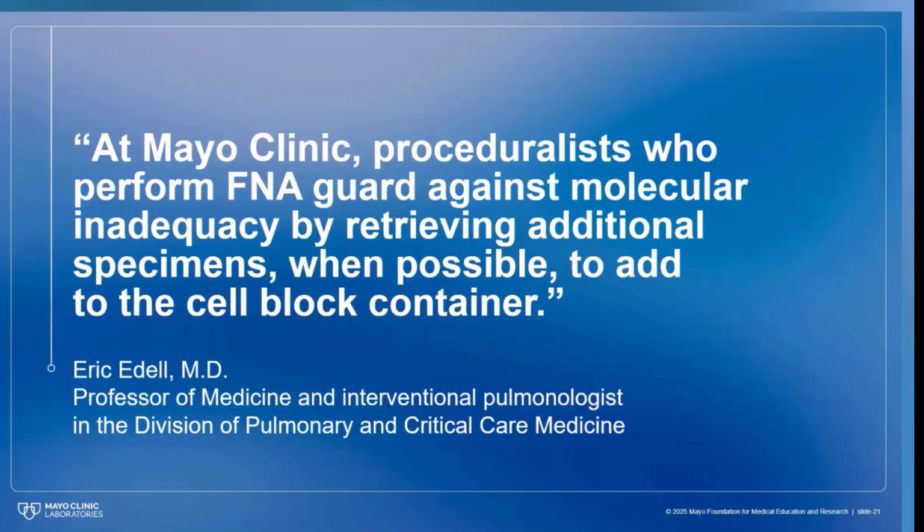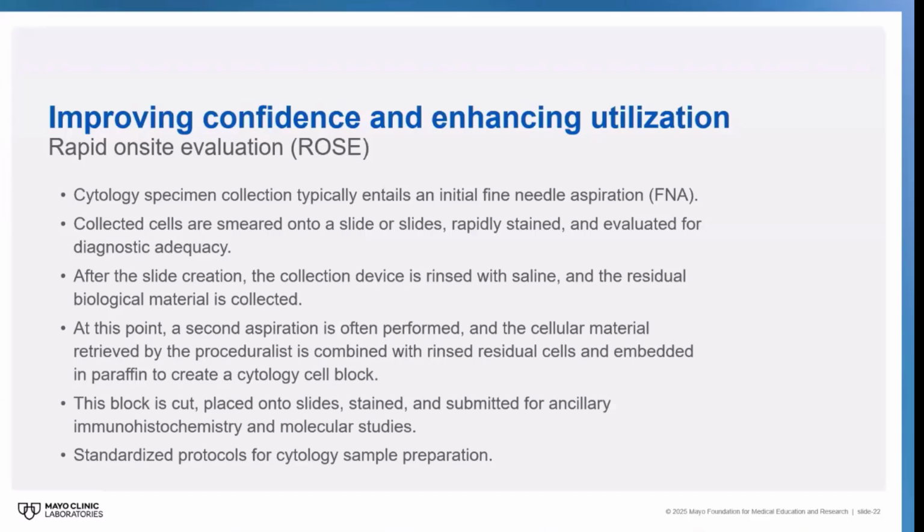Oh, please go back to the previous slide. So he said, at Mayo Clinic, the proceduralists who perform FNA guard against molecular inadequacy by retrieving additional specimen when possible to add to the cell block container. Let's see Katie's interpretation of this quote. Next slide. Thanks, Dr. Lowe.